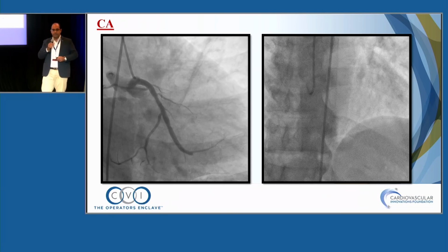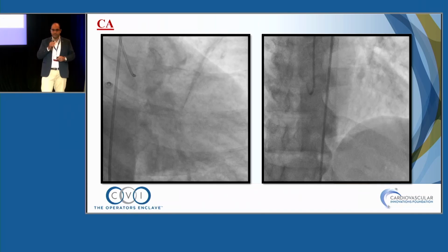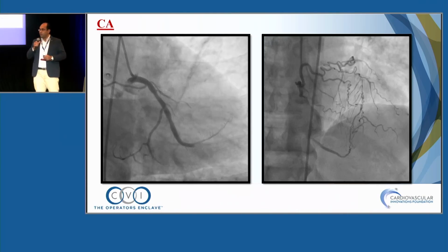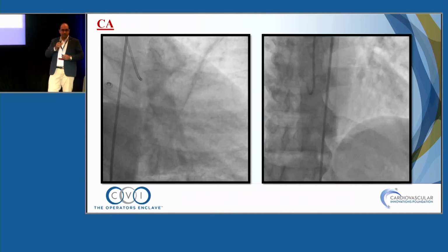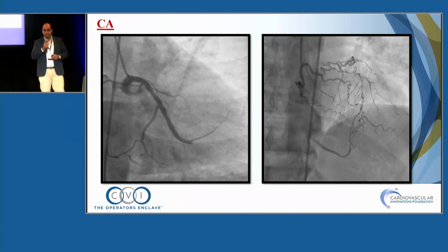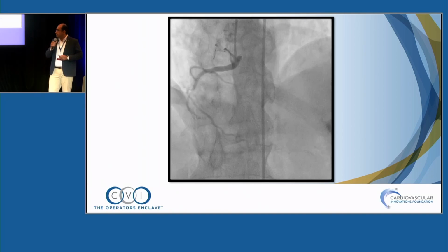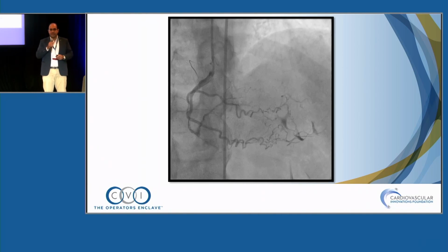He had some slow flow with a patent proximal LCX stent and total occlusion of the distal OM. And this is a shot at the conal branch of the RCA, where it gives very well-formed collaterals to the LAD. And this is the RCA angiogram. You can appreciate the long segment of occlusion with woven anomaly.